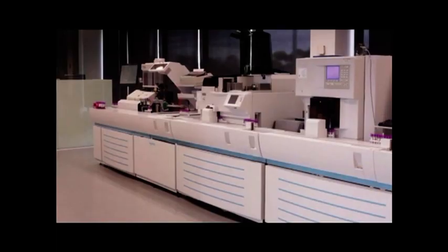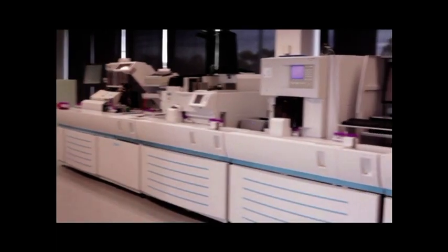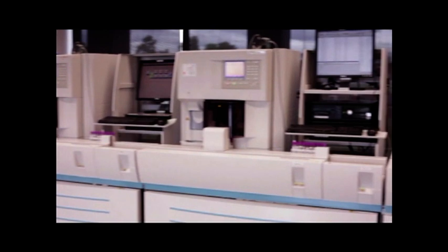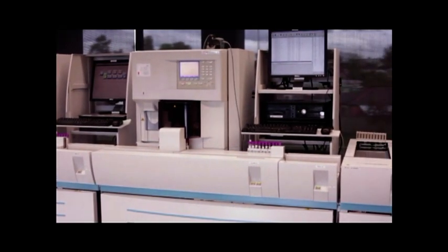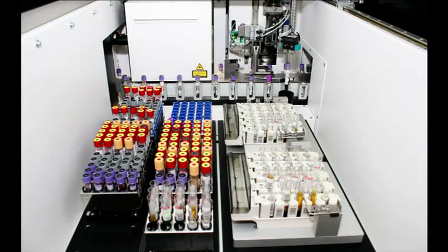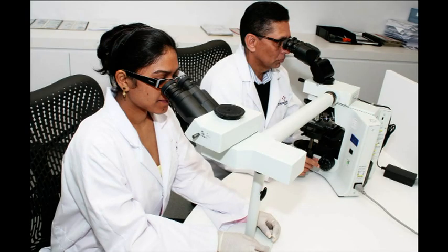Biochemistry, Haematology, Microbiology, Serology, Immunology, Toxicology, Cytology and Histology.